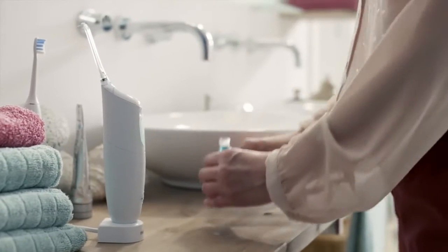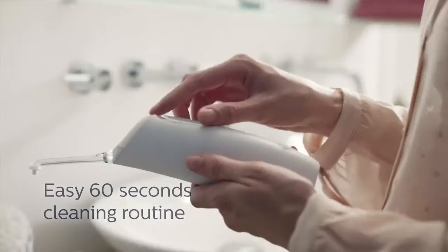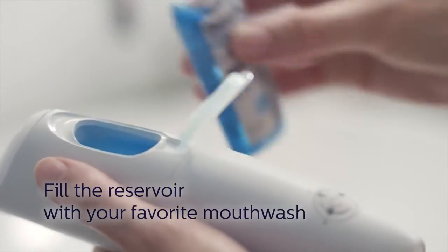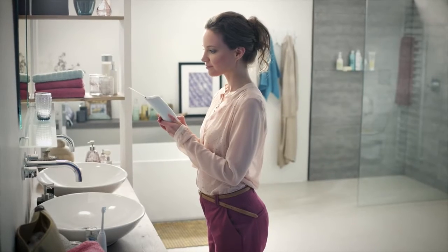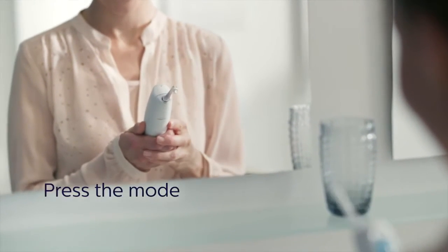We offer you three easy steps to improve your gum health in less than 60 seconds a day. Insert the nozzle. Fill the reservoir with your favorite mouthwash for the ultimate fresh experience. Press the power mode button to turn on Philips Sonicare Air Floss Ultra and select the desired mode.